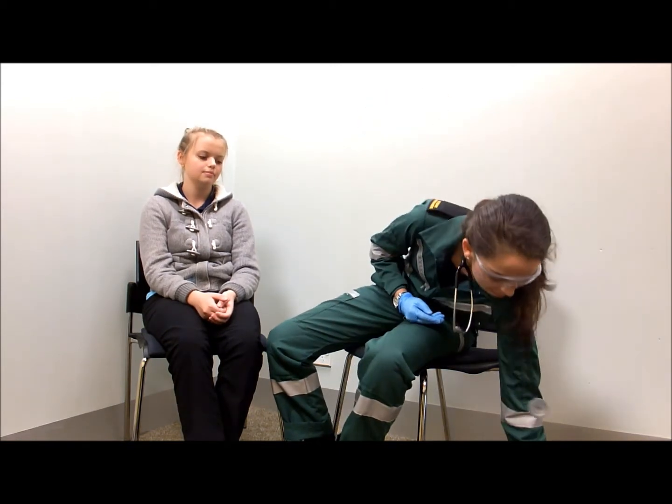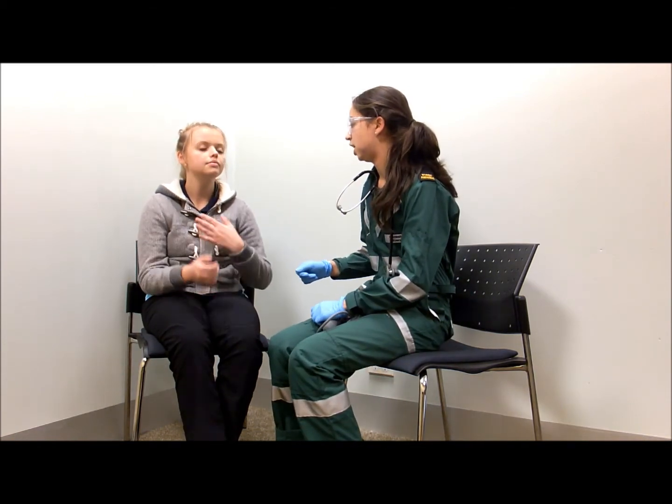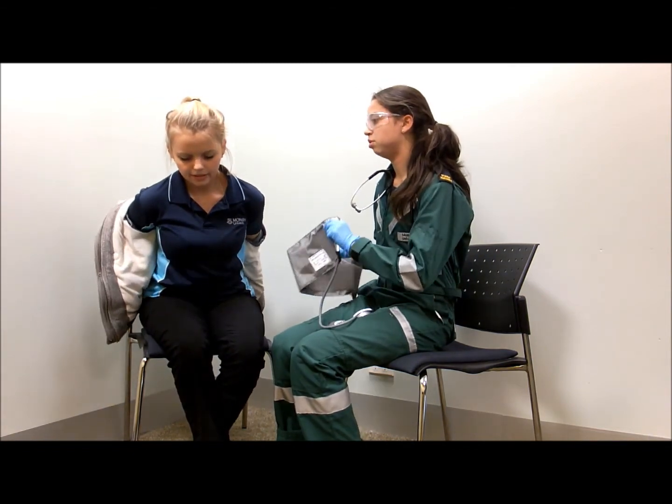Is it okay if I take your blood pressure? Yeah, sure. Okay, now I'm going to demonstrate how to take Mrs. Jones's blood pressure. Mrs. Jones, I'm just going to need you to take off your jacket while I take your blood pressure so I can get a more accurate reading. Yep. Have you ever had your blood pressure taken before?